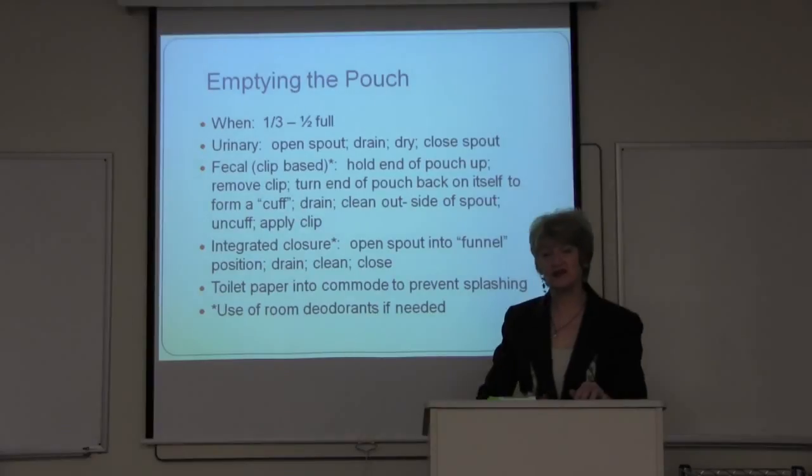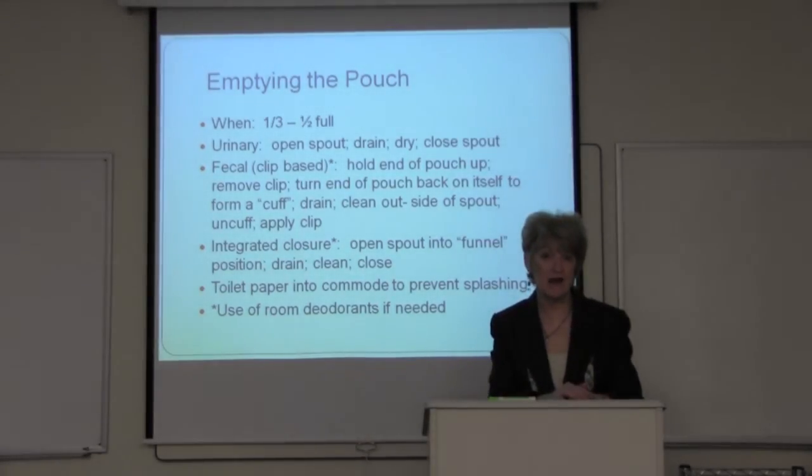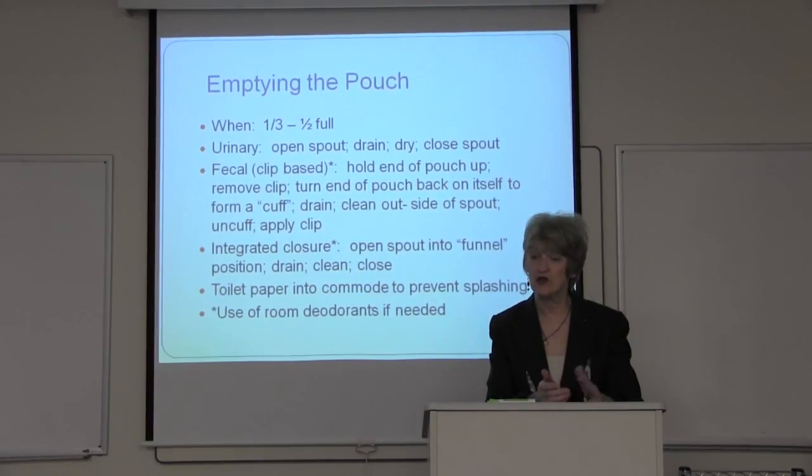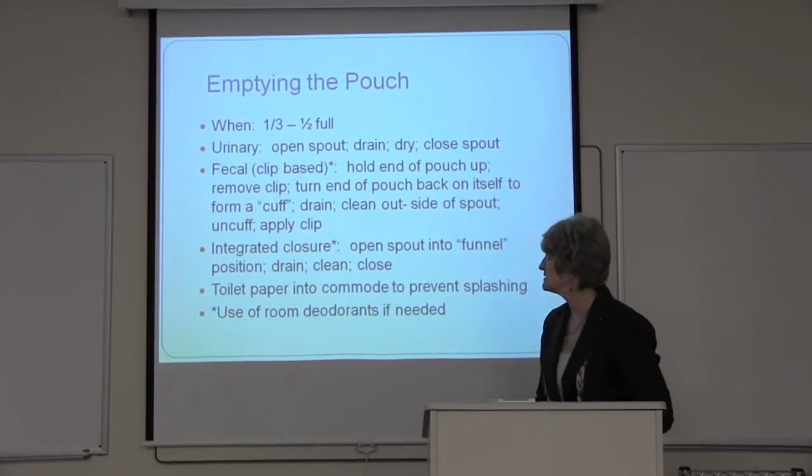So the last couple of things I wanted to go over before we talk about common types of peristomal skin damage, I wanted to just briefly go over how to empty and how to change. And again, we'll talk more about this when you're on site, but I wanted to just go over the basics.